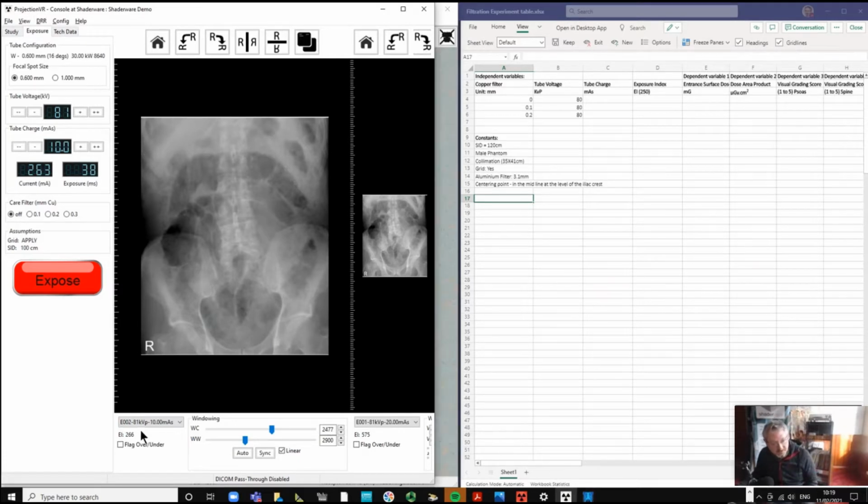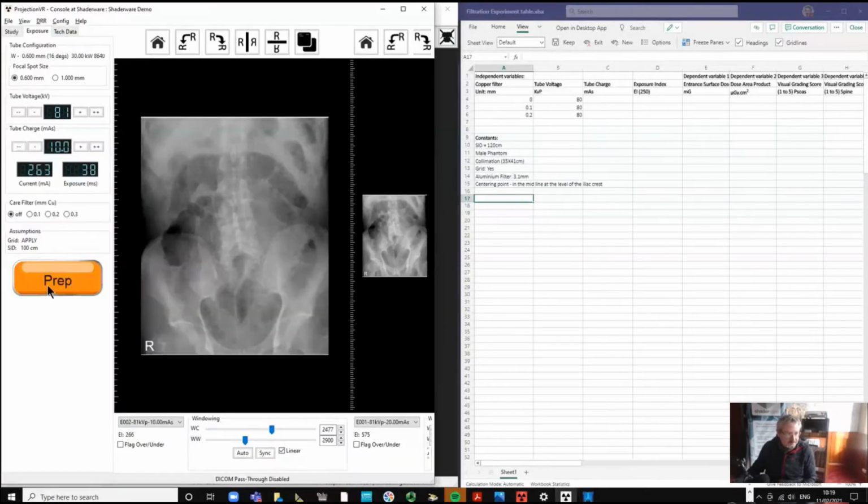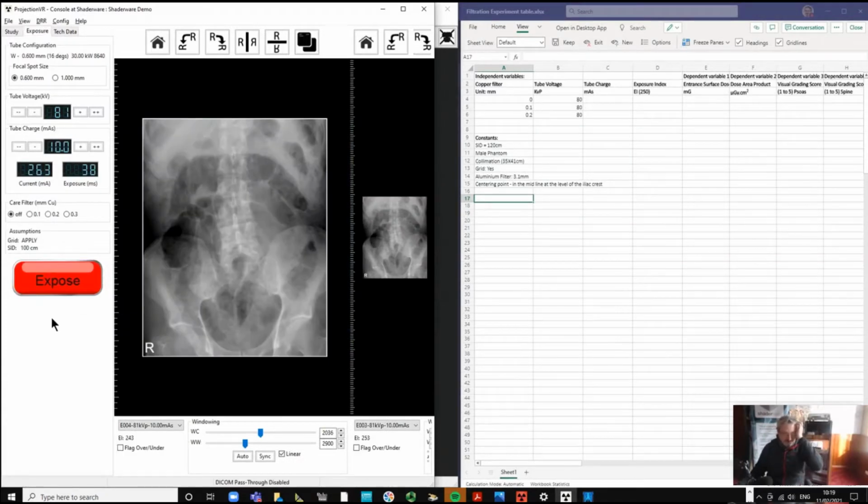Okay, so that worked. Look, we're now at 266, which is pretty close to 250. My tweak with the sideways collimation didn't work. We've still not got the collimation in. But we have now got just the top of the symphysis, which is much better. You agree? Yes. So I'm going to drop this just a little bit more and see if we get four collimation marks on. Yay!